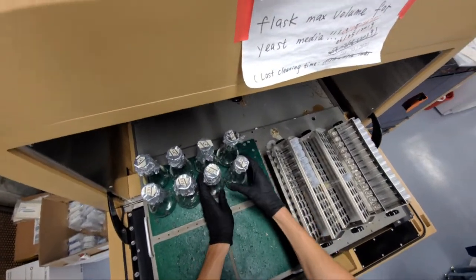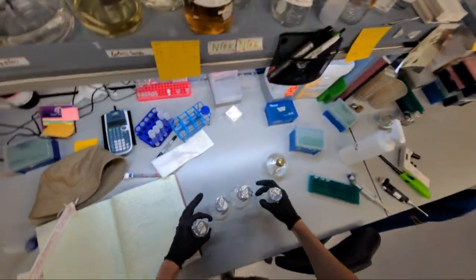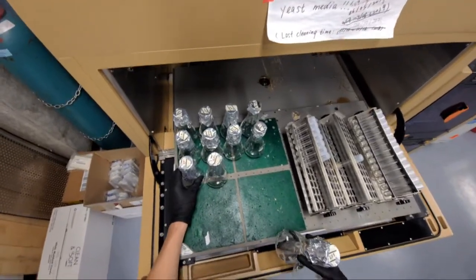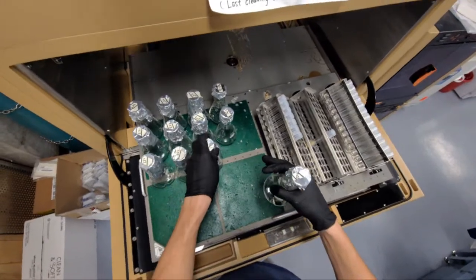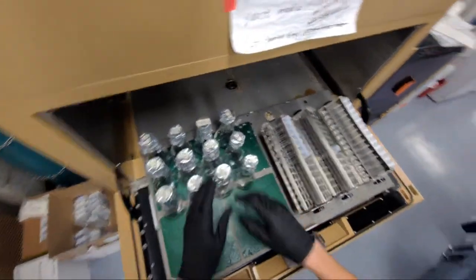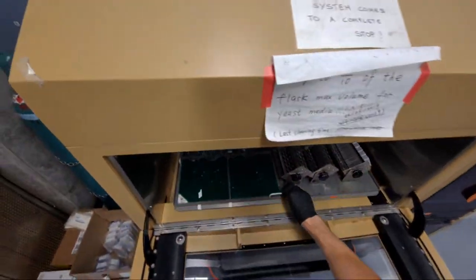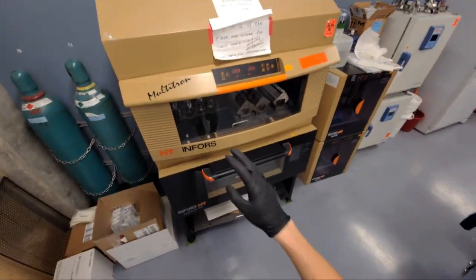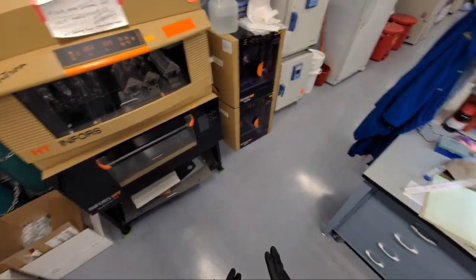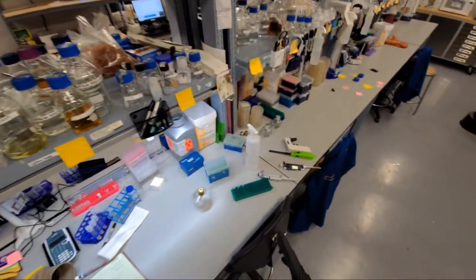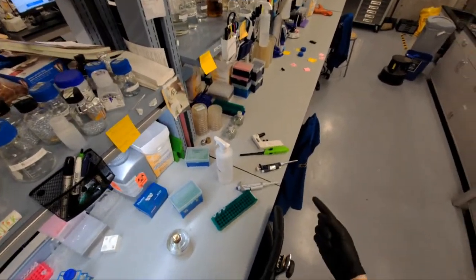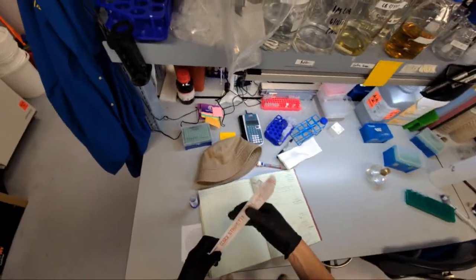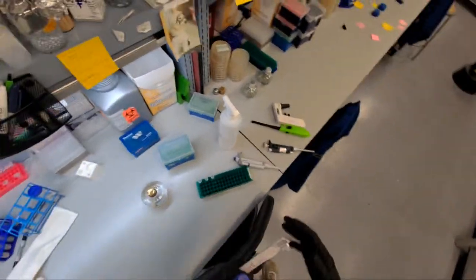So this is very minimal media, and the cells need to adjust from the YPD condition, so the rich media condition, to this very restricted minimal media that's basically just salt water and vinegar, salt water and neutralized vinegar. So this is a really stressful condition. Normally, cells will start growing within the first five hours or so. But in this minimal media, switching medias and everything, we won't get any noticeable growth for like 40 hours. So not tomorrow, but the next day at 9 a.m., I'll come in and take the first readings, and hopefully the data looks good.